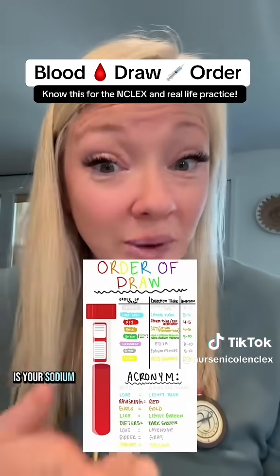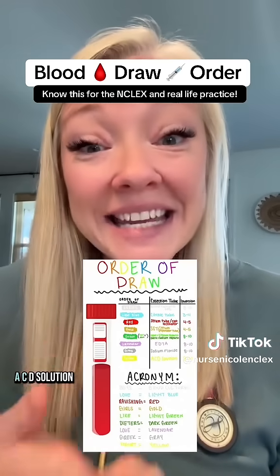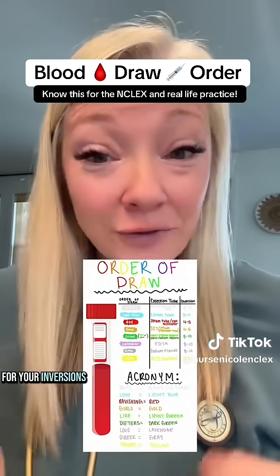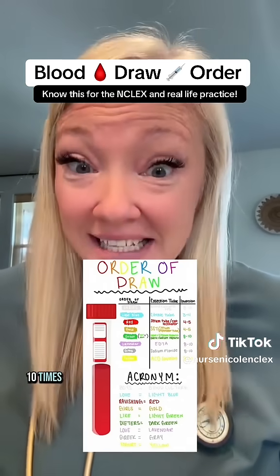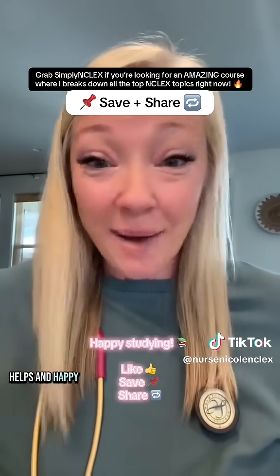Your gray is your sodium fluoride tube. Then you're going to do yellow last, which is your ACD solution tube. For your inversions, you usually do them eight to ten times, unless it's a serum separator tube, and then you usually do it four to five. I hope that helps and happy studying.